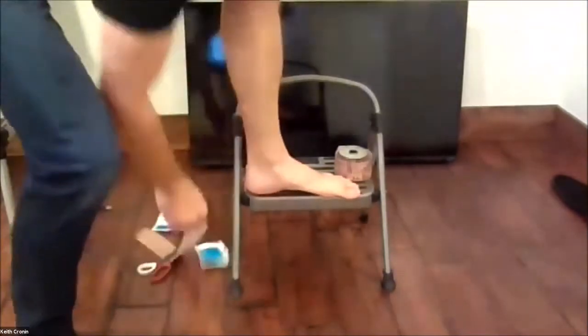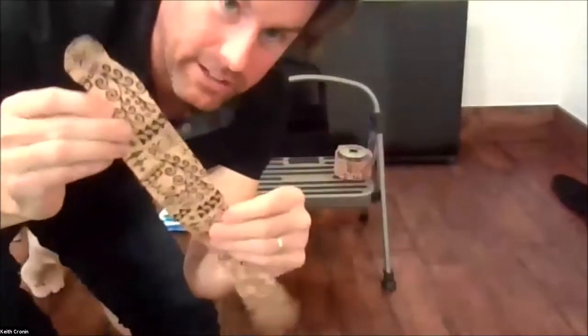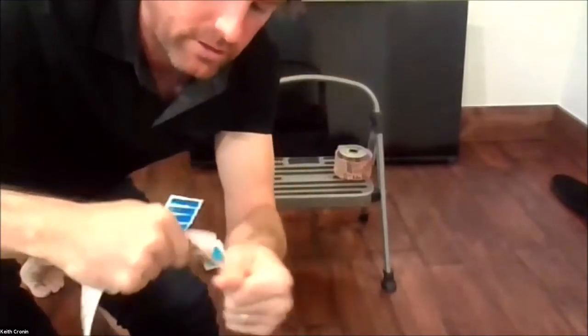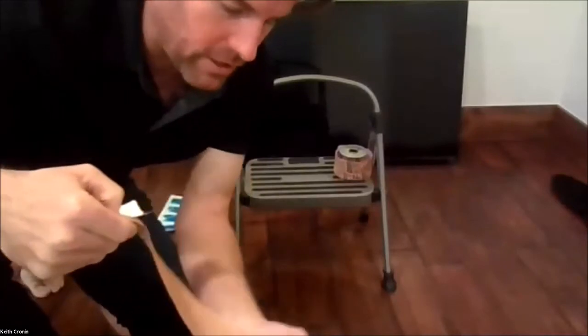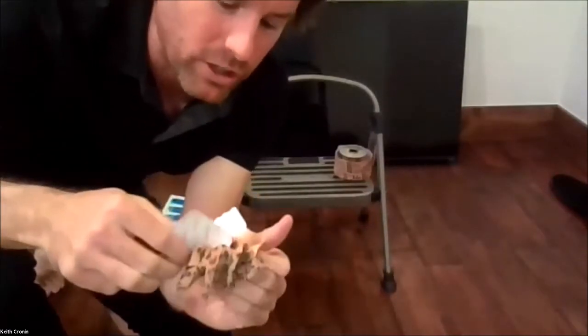Okay, now, here we go. Here's this little bungee cord tape. Now, you're gonna see here, this is dynamic tape. So this acts like a bungee cord on the body. So if I take this and I'm gonna put it on a shortened position on my foot, and the cool part is, and I'll just show a quick example. If you have kinesiology tape at home, it does not do this, all right? That's because this has high recoil to it.